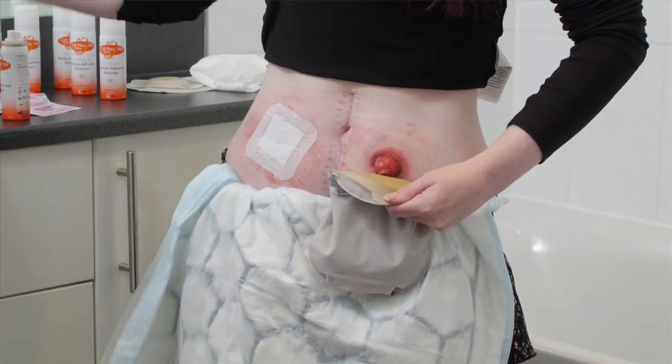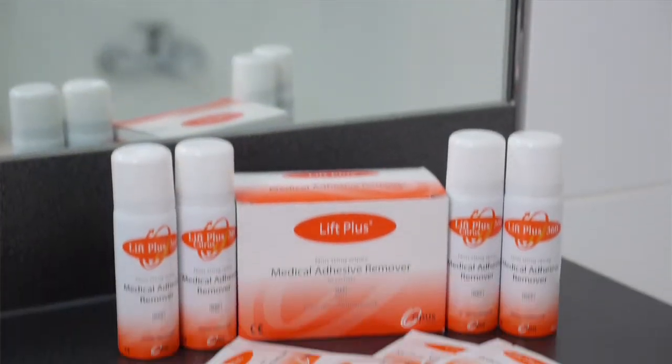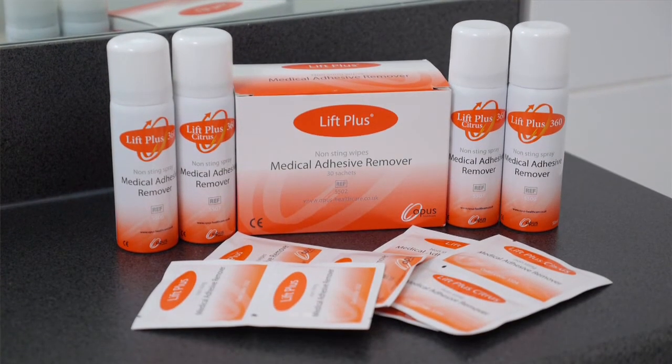The best thing about having an adhesive remover like this is it doesn't inflict on any sore or broken skin that's already present if you've had leaks. The skin is really delicate, and the peristomal skin becomes even more delicate because waste can touch the skin and burn it. When you're continually peeling the bag off you can damage the skin, and the adhesive remover prevents this, which is very good for my skin personally.